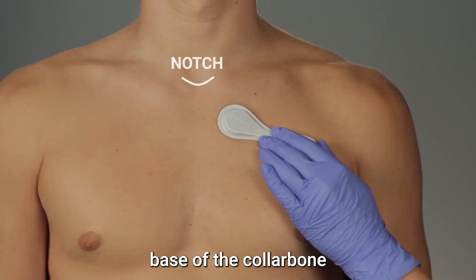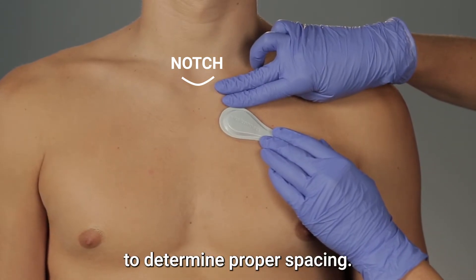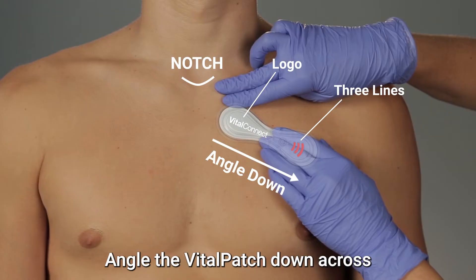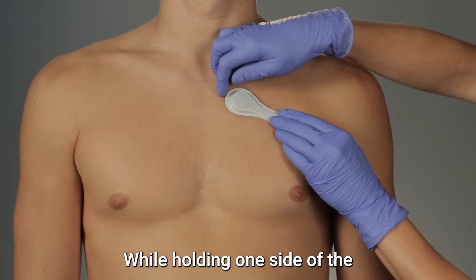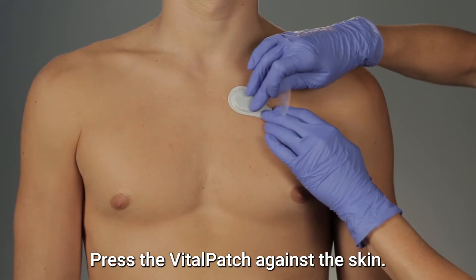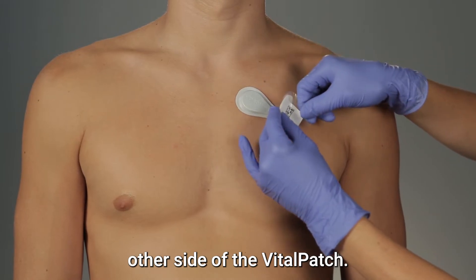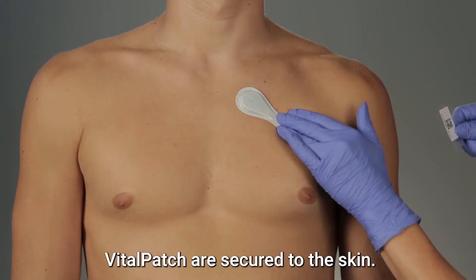Locate the notch at the base of the collarbone and hold two fingers below to determine proper spacing. Hold the Vital Patch against the upper left chest with the logo side lined up with the center of the chest. Angle the Vital Patch down across the heart, with the three lines pointing down. While holding one side of the Vital Patch down on your chest, lift the opposite side and peel off the adhesive backing. Press the Vital Patch against the skin, then peel off the backing on the other side. Press down and around the sides to make sure all edges are secured to the skin.